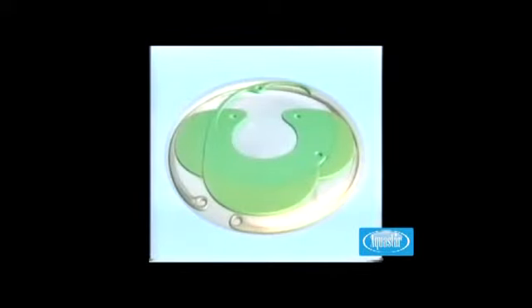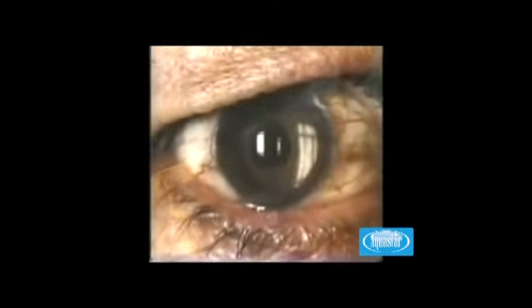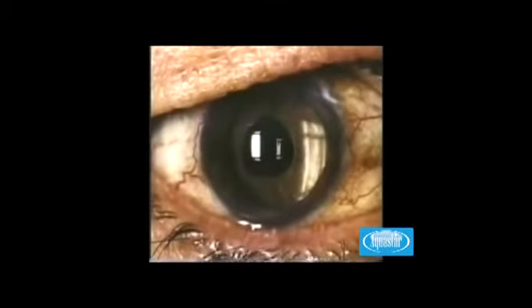The integration of the capsular IPS elements into primary treatment makes it possible to insert them into the capsular bag because the capsule lamellae have not yet grown together. In secondary treatment, this possibility of capsular positioning is either hampered by the adhesion of the capsule lamellae or is no longer possible at all. Artificial iris reconstruction suited to individual findings can be performed in the capsular bag using IPS, the iris prosthetic system. Pupil sizes of 3 or 4 millimeters can be created as needed.